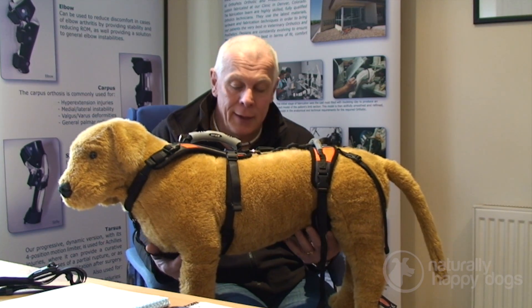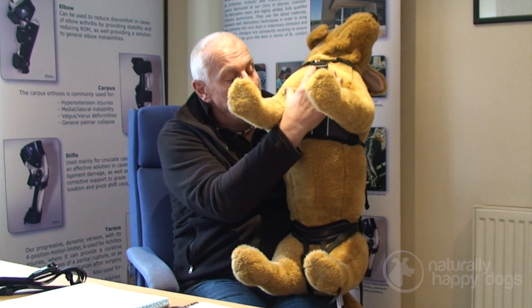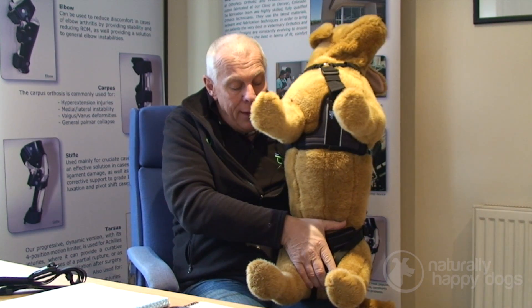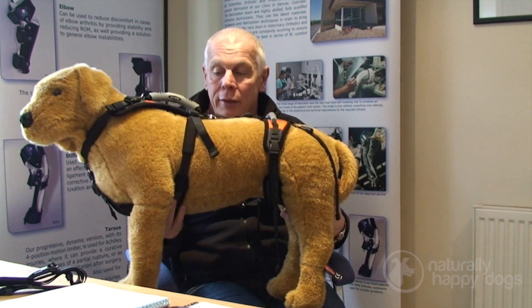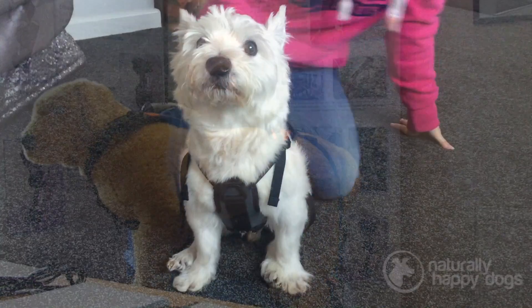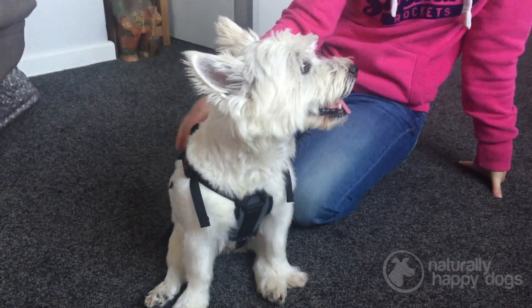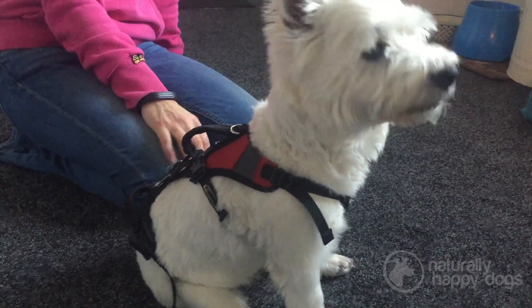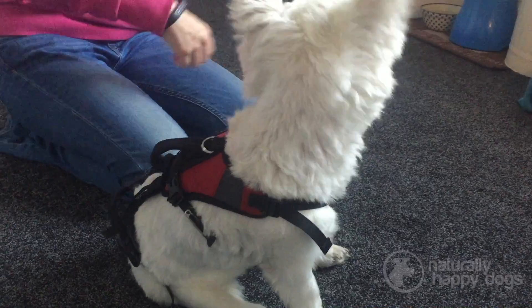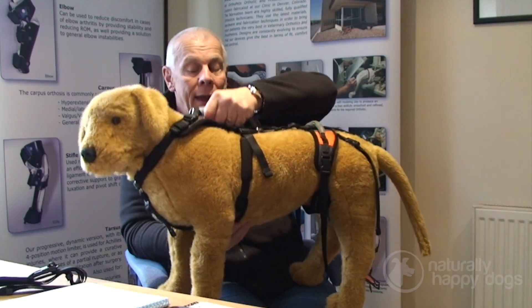The Help Them Up is designed to spread the weight of the dog over a good area of the sternum and around the pelvis, so that you're lifting the dog while spreading the load and making it comfortable. The device really helps you, the dog owner, to help your dog — it lifts the dog correctly and, just as importantly, allows you to help your dog without injuring your back and having to visit your osteopath or chiropractor.